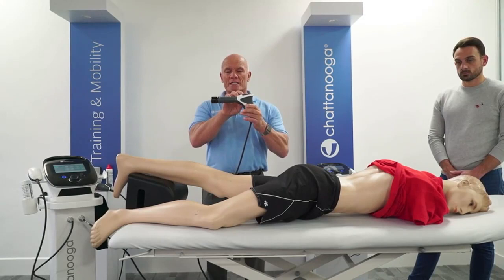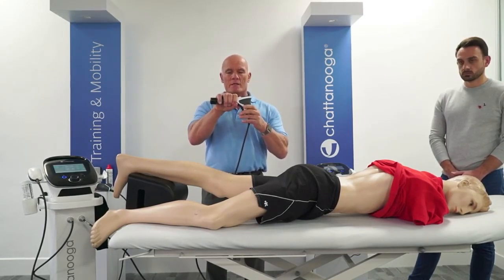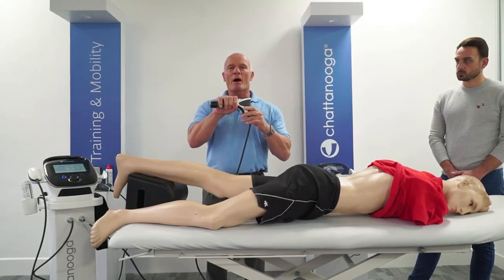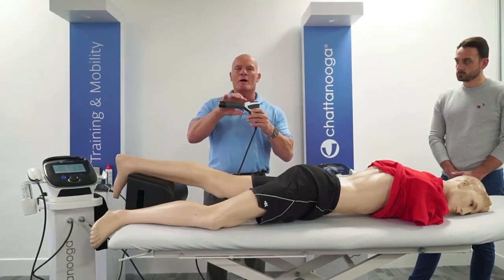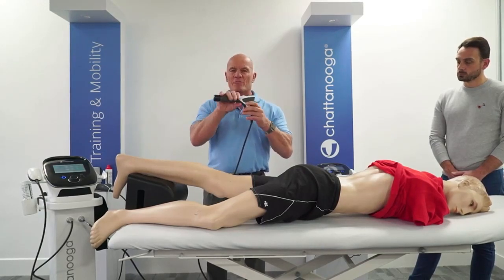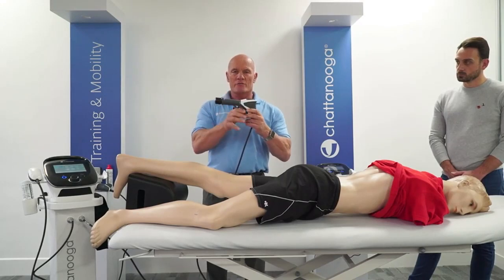It also dictates how much pressure there is in this barrel. And that's measured in bar pressure. So you're going to hear people talking about 4 bar, 5 bar. This is a 5 bar handpiece with a 21 hertz frequency.